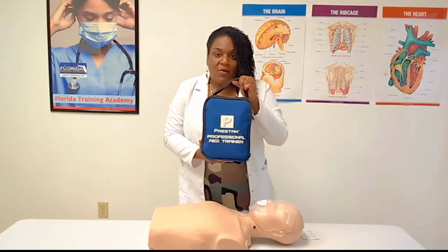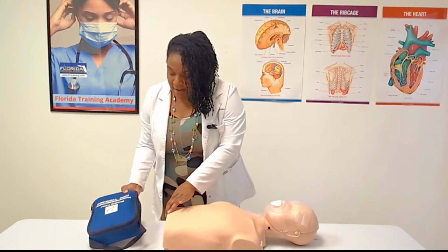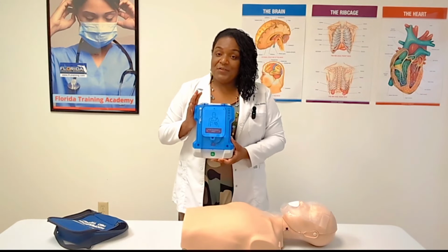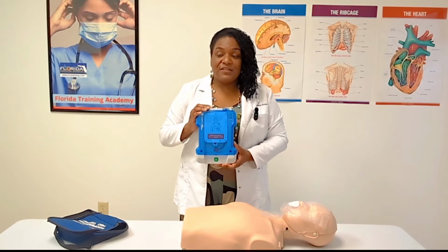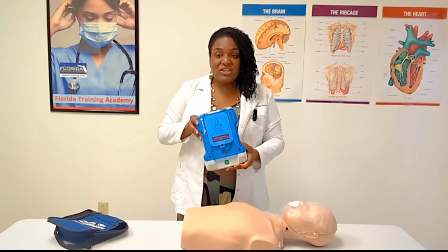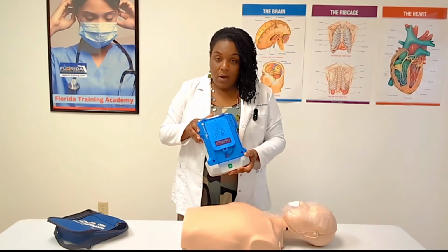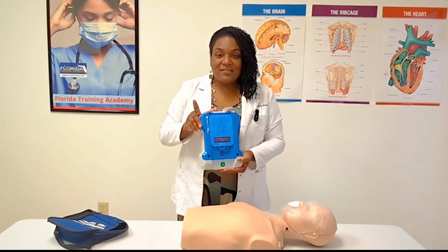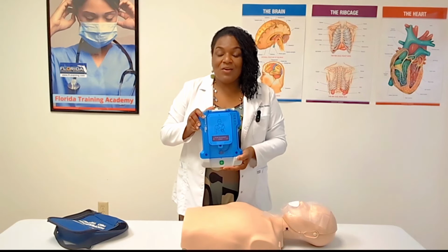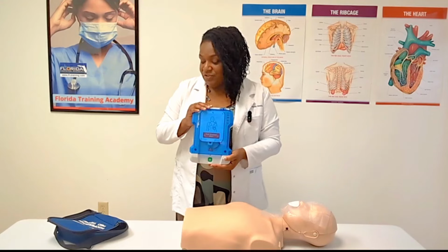For our scenario, help just brought the AED. So we're going to open up the case. Our AED just arrived to the scene, and if you've never used an AED before, they're super easy to use. They are voice guided. So even when you take it out of the packaging, it will automatically turn on. If you open the case, it may also automatically turn on. Worst case scenario, find the power on button, because once it is turned on, it will guide you through all of its processes. And let's demonstrate now.